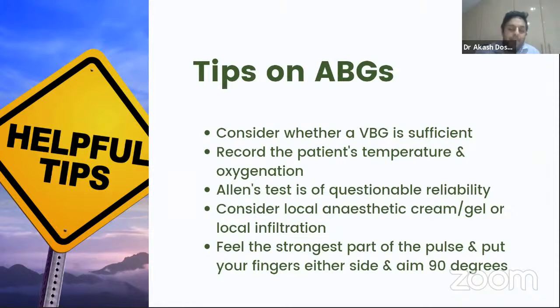But for example, if you've got a patient who's had a blood gas, they've developed type 2 respiratory failure and they've started NIV or BiPAP or something, then you know they're going to need regular gases. So you could do the first gas, but after that, you really should be giving them something to numb that area so that subsequent gases don't hurt so much. You can also consider local infiltration. I think it's really useful for patients who you can't feel a very good pulse, and who you think are going to take a little bit of time or difficulty or multiple attempts to get that gas. Arguably, some patients won't want 2 needles, one to do the infiltration and one to get the ABG. But those who are going to have multiple needles may well want that one extra one to prevent so much pain on all the subsequent ones.